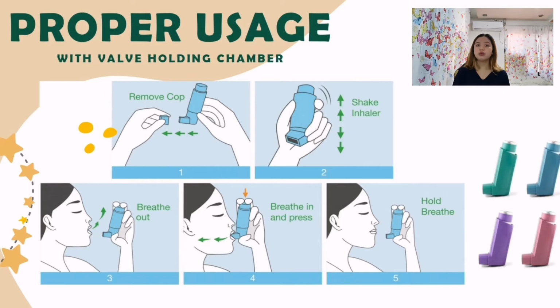Lastly is to hold your breath for 10 seconds to allow the drug to reach the lungs' airways. Repeat the steps above for each puff your doctor has authorized. Wait roughly a minute between your puffs. When you are done, replace the cap on your MDI.